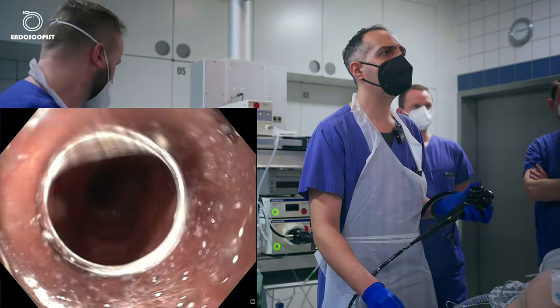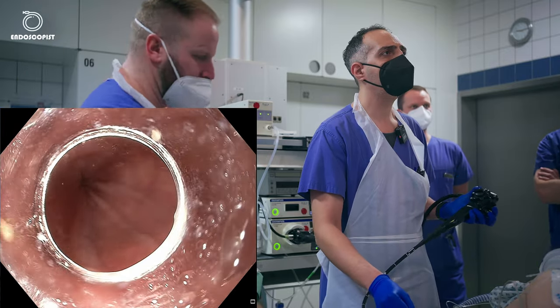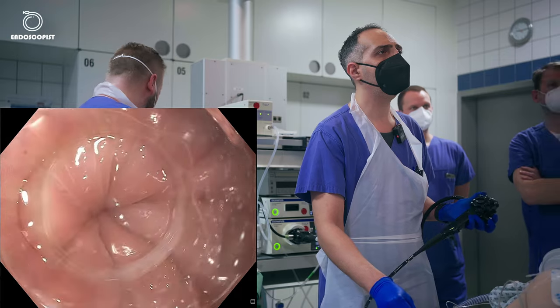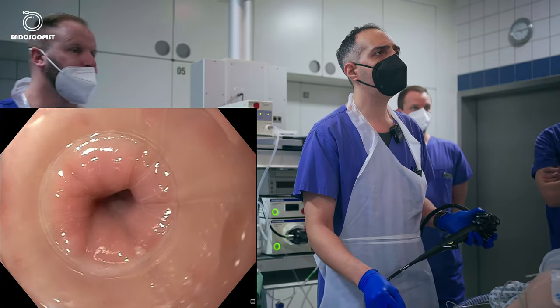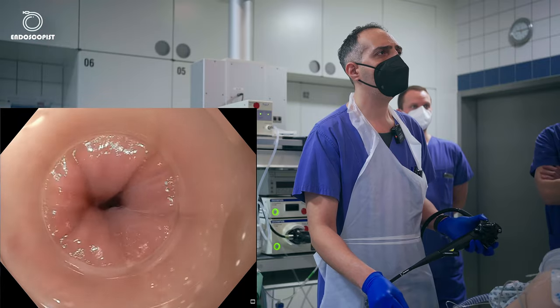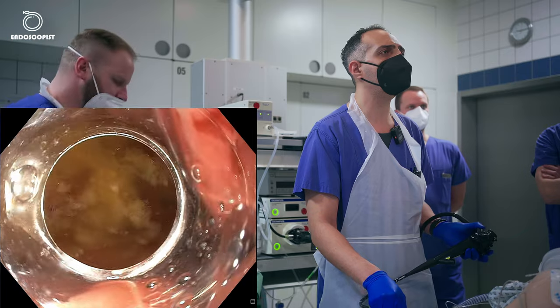So I will pause. So it's hugely dilated. And we see here this spasm at the cardia, with gentle pressure, and I'm in the stomach. So this is the food we pushed from the esophagus to the stomach.